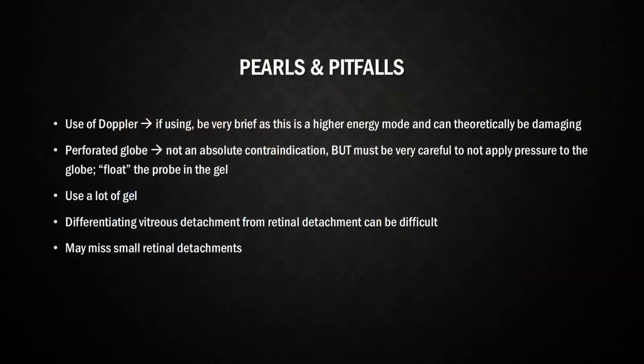So last is just some pearls and pitfalls. Use of Doppler, if using it, you just want to be brief. It is a higher energy mode and can theoretically be damaging. So you don't want to be sitting there with Doppler on the eye for a prolonged period of time. In addition, perforated globe is traditionally thought to be an absolute contraindication to this, but it isn't. You can do this ultrasound on someone with a suspected perforated globe, but you just have to be really careful.